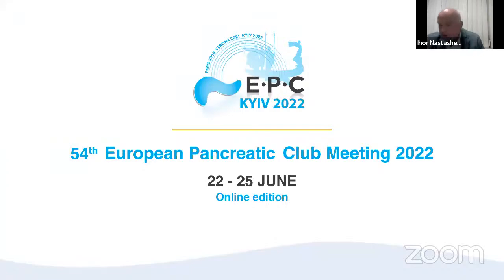One question, please. Do you have duodenal perforation by endoscopic papillectomy? Yeah, thank you for your question. We did not observe this complication in the EP group. And if you have a look at the literature, duodenal perforation is a very rare complication.